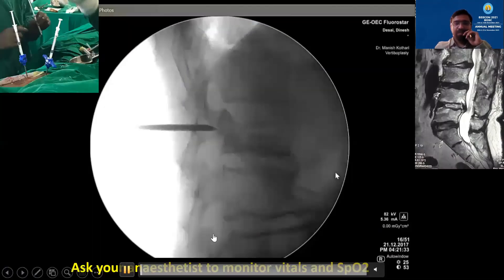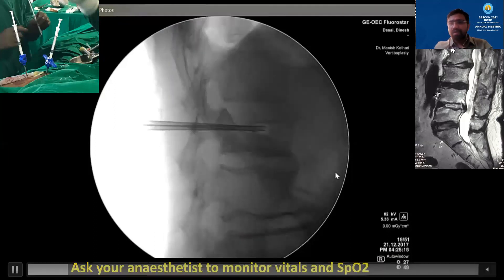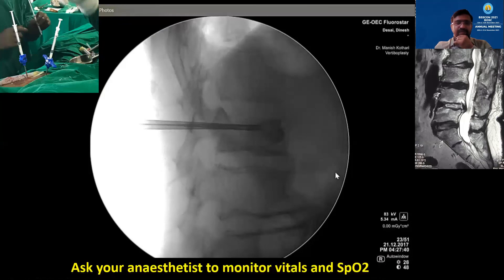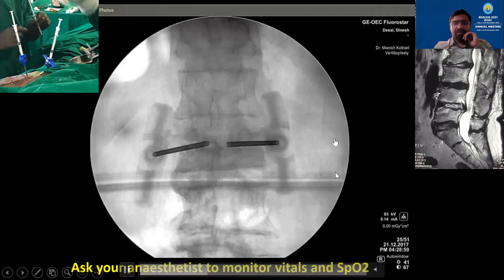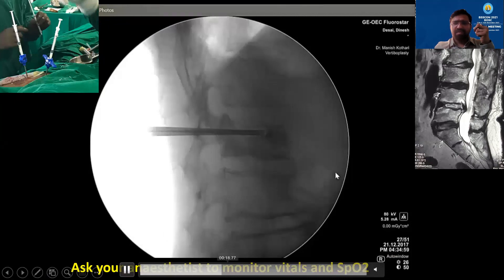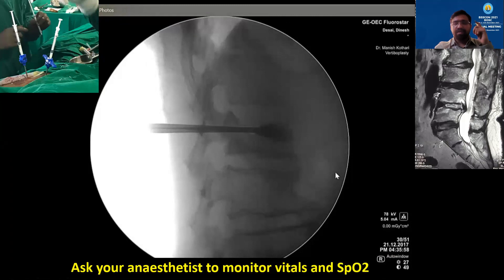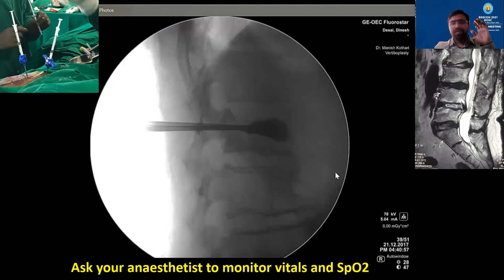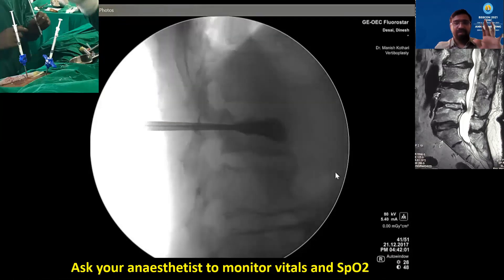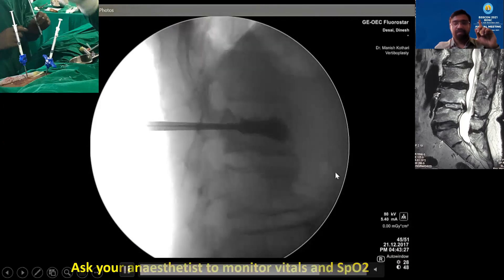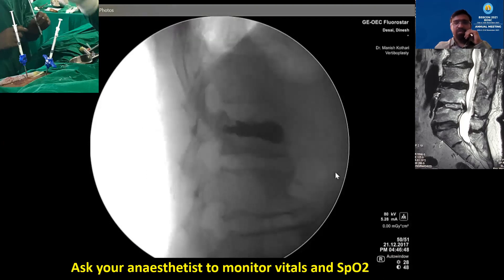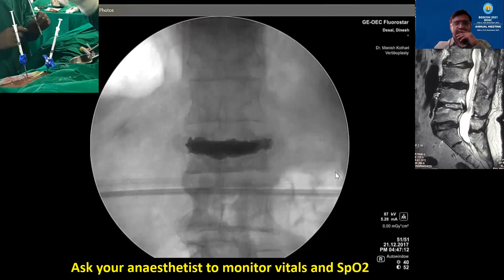Here is a quick video of the cementing on a Kummel's lesion. I inject the dye first to confirm the needles are in the correct position filling the fracture. Then I start injecting the cement — only 0.1cc each time — using pulsed fluoroscopy, not continuous. With Simplex P in a cold OT, you have around four to five minutes of working time; in a hot OT, barely two minutes. Make sure your OT is very cold and the cement has been kept in the fridge. Gradually fill the fracture as much as needed, but don't come too close to the posterior cortex.